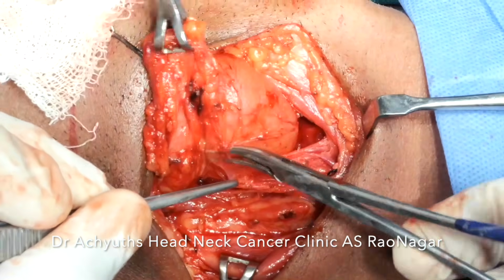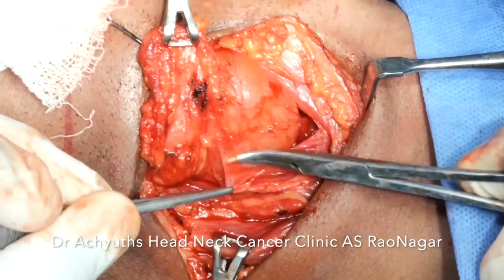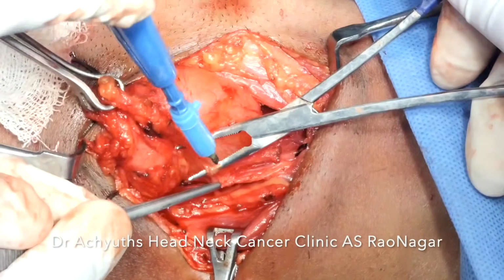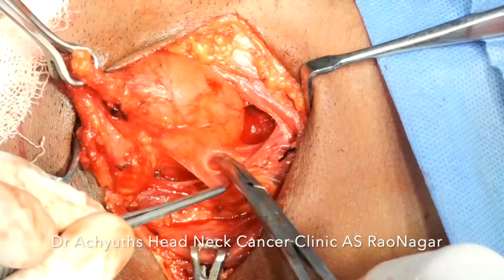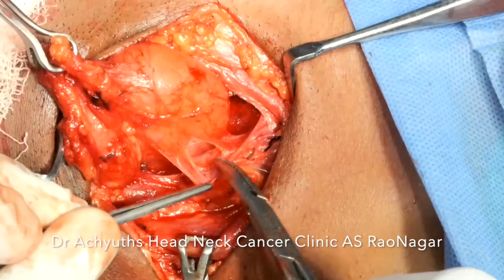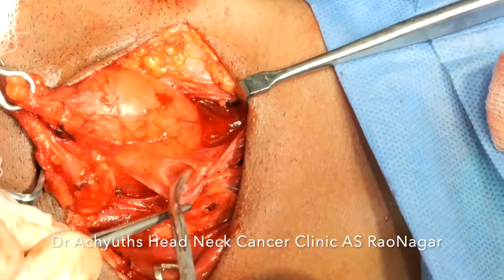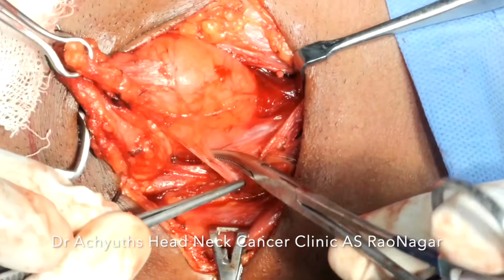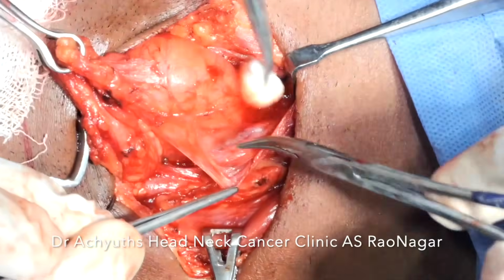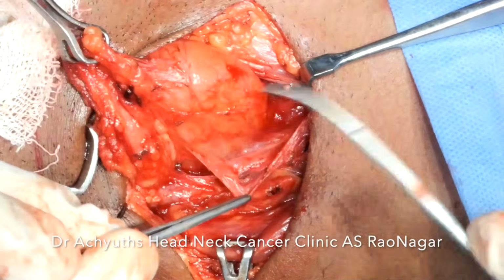Then, after the cyst wall breaks, we have to excise it from whichever structure we think it is attached to, because when the cyst is intact we know the boundaries of it, where it is going and what it is attached to. So it is very important that we preserve the intactness of the cyst wall during the entirety of the surgery.